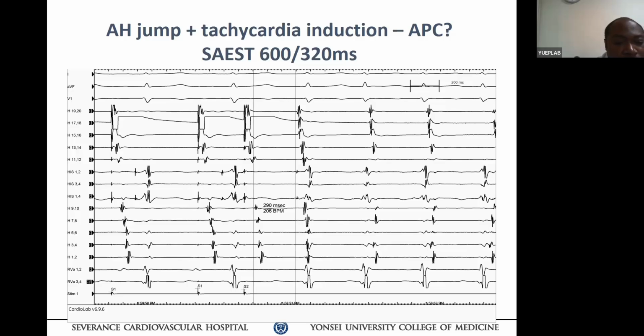Or the patient has what other explanation? A double tachycardia going on, simultaneous. There is such a thing. A double tachycardia is well reported, fascicular VT with AVNRT, and so on, because AVNRT is a disease that doesn't need anything else. Therefore, there's room to have another tachycardia of a different nature coincide together. Otherwise, you can explain this.